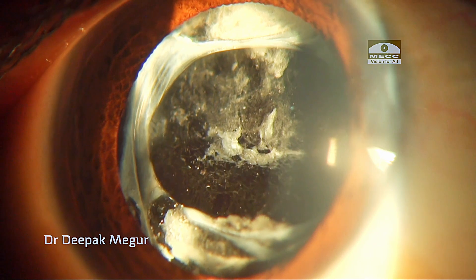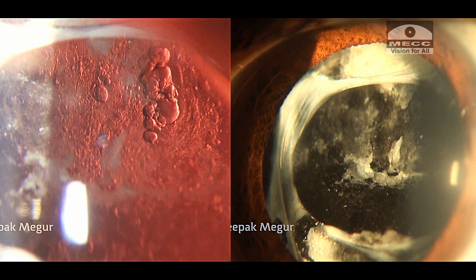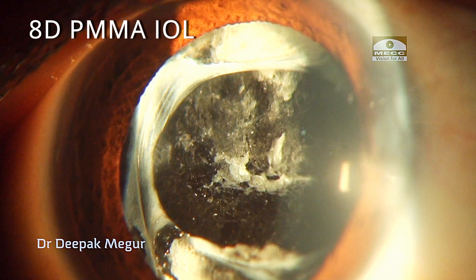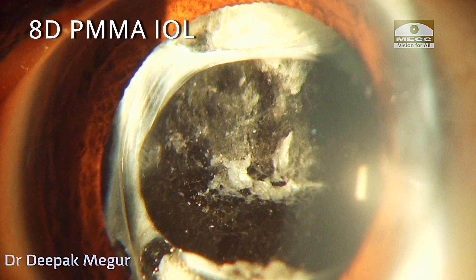Hello friends. This is an old case from my library, but it's an interesting case with lots of unexpected twists and turns, so I thought I would share it. A 24-year-old male patient presented with pseudophakia in the right eye with a thick PCO. He underwent cataract surgery for developmental cataract 14 years back, and his records indicate he had an 8-diopter IOL, which is a PMMA lens, implanted in his eye.